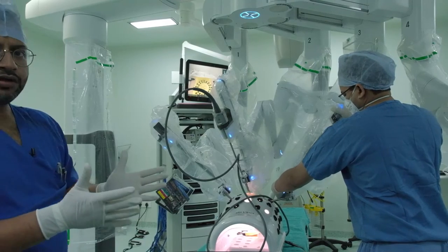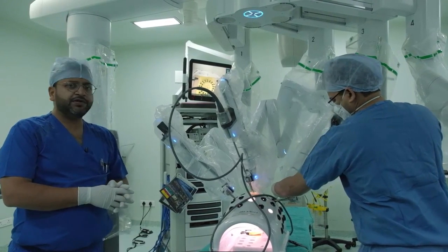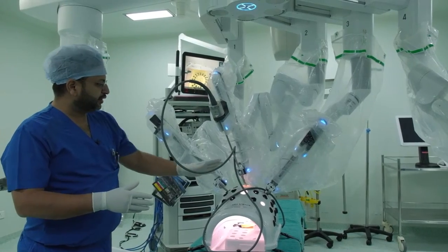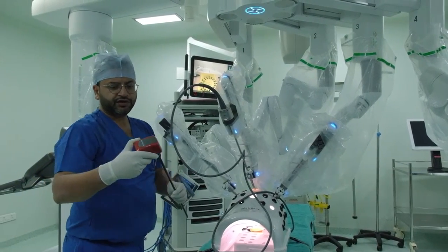Then we take the robotic instruments and we place them in position in the various arms. Now the docking has been complete. You can see all the three arms are docked. And now we can put in the training instruments.